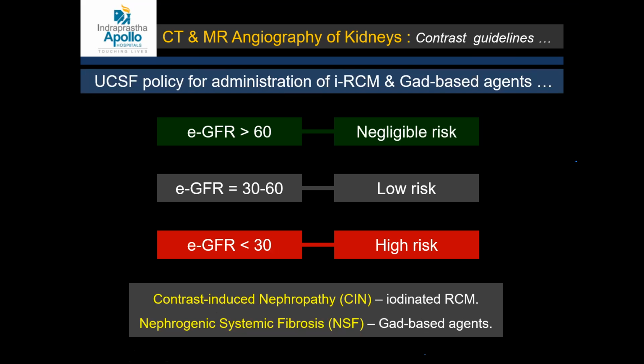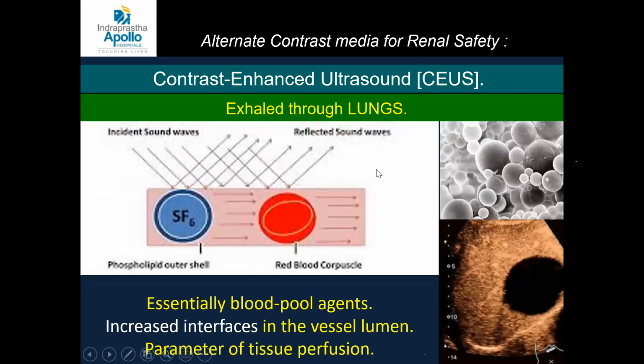subjected to contrast studies. So it is important now to understand if the patient cannot be given any contrast, IV contrast, because they are excreted through the kidneys and the KFT is not normal, serum creatinine is elevated, as is a common setting in nephrology practice.